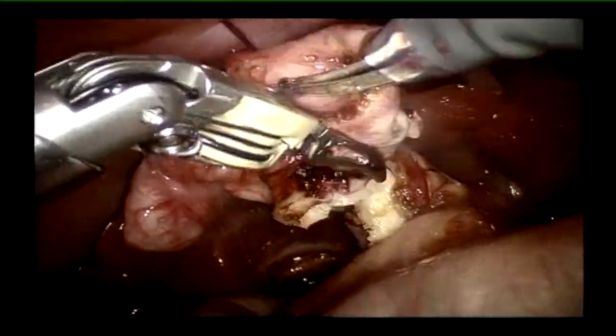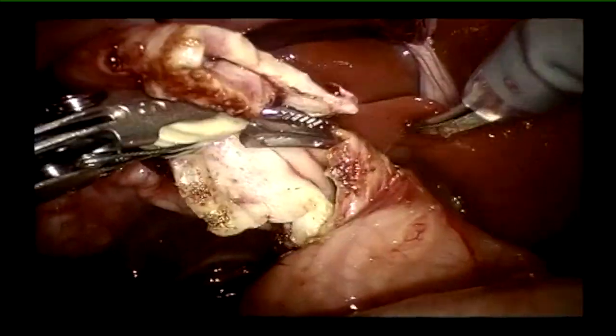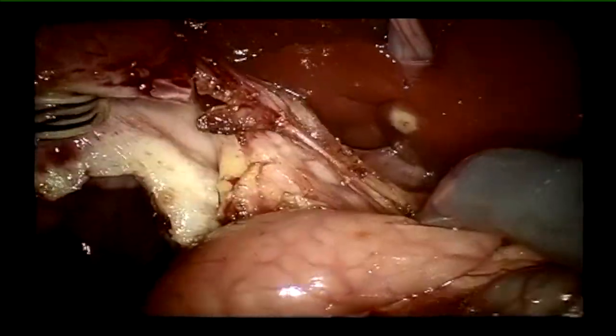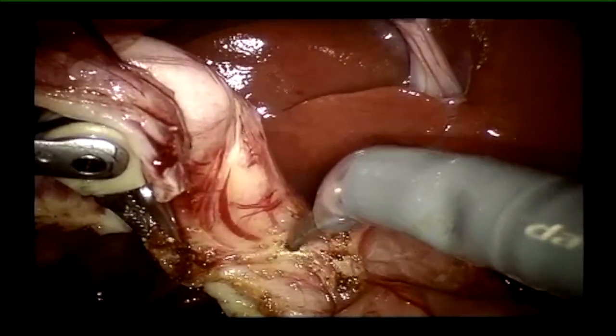Can this be done laparoscopically? Of course it can, but it will take much longer, there will likely be a little more bleeding, and the vision won't be as good as you get with these robotic telescopes.